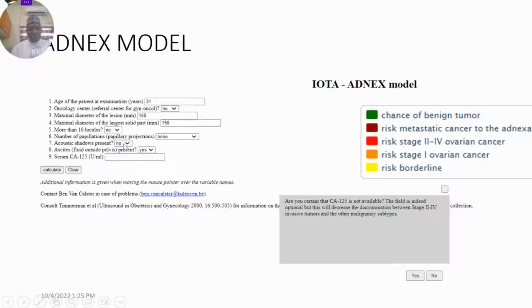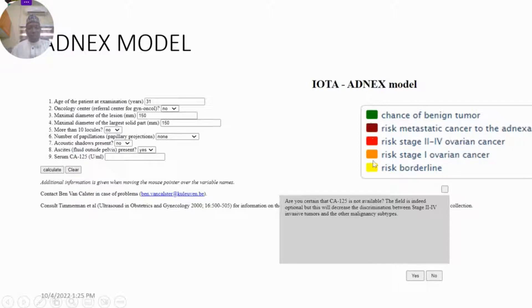I have inputted the variables of a patient we managed without CA-125, which is an optional variable. When you click on calculate, a box will pop up asking whether you are certain that CA-125 is not available. This field is optional, but omitting it will decrease discrimination between stage 2 to 4 invasive tumor and the other malignant subtypes. When you click yes, the analysis will pop up with color codings: benign tumor chance, risk of metastatic cancer to the adnexa, risk of stage 2 to 4 in red, risk of stage 1, and borderline tumor in yellow.